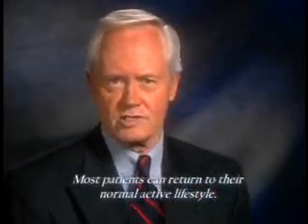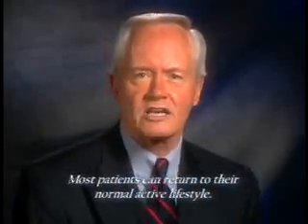Once the patient is in remission and has completed the treatment, it is recommended that they receive 1 treatment session per week for 4 weeks to reinforce the changes made and to monitor the patient's weekly activities. There is no reason that patients cannot return to their normal active lifestyle. Patients are discouraged from returning to heavy-duty work with heavy lifting, as the potential for re-injury and relapse is high. Most patients can expect a long-term result with VAX-D and can return to light or moderate duty work.